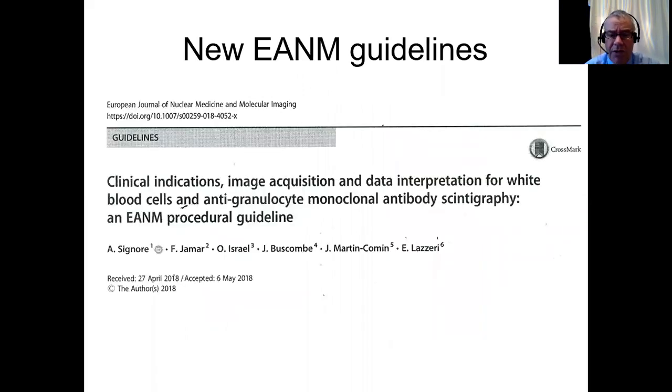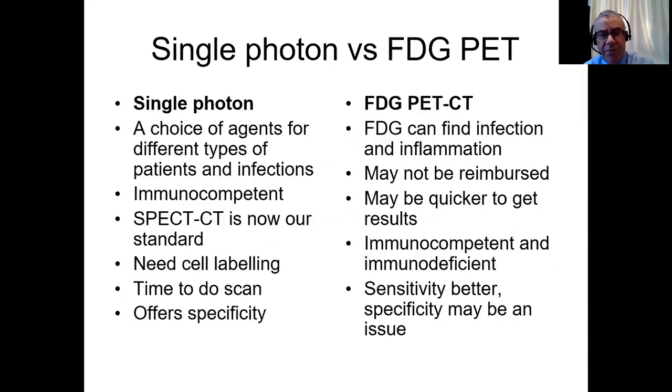If you want to look at some guidelines of when to use labeled white cells, we developed some guidelines which are available free online through the EANM portal. This gives you some idea of when you should use it and how you should report labeled white cell studies, or if you've got them, antigranulocyte antibodies.